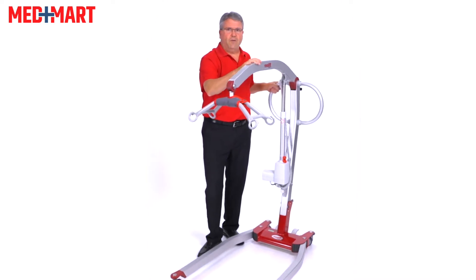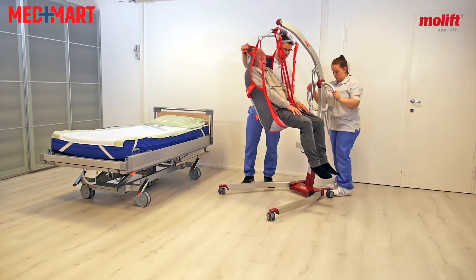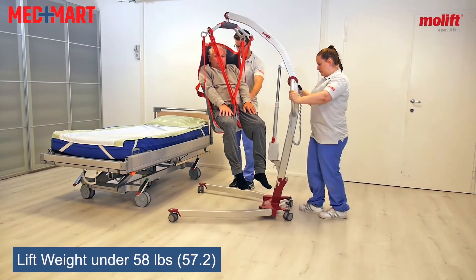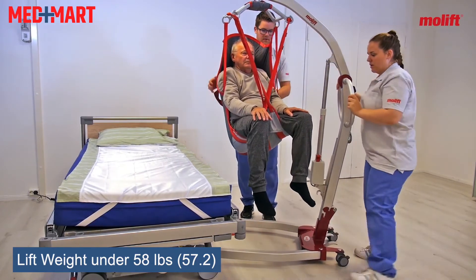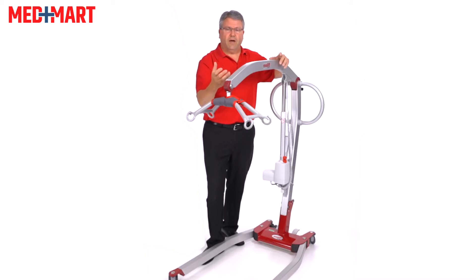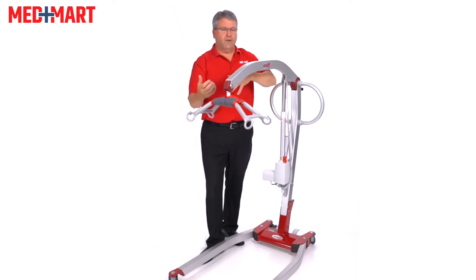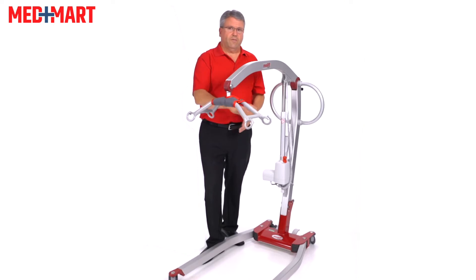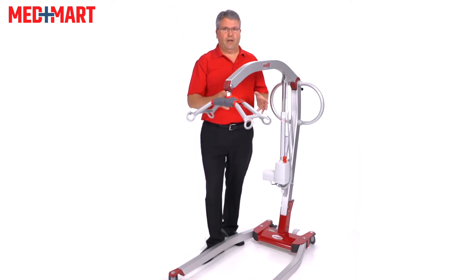There's also a large oversized ergonomic handle, which makes this really easy to move around. What makes it even easier is that this lift is under 58 pounds. If you're lifting somebody who's 180 to 200 pounds and adding a lift weight — the average steel lift goes anywhere from 80 to as high as 110 pounds — it makes a big difference when moving room to room, especially if you have carpet with some padding.